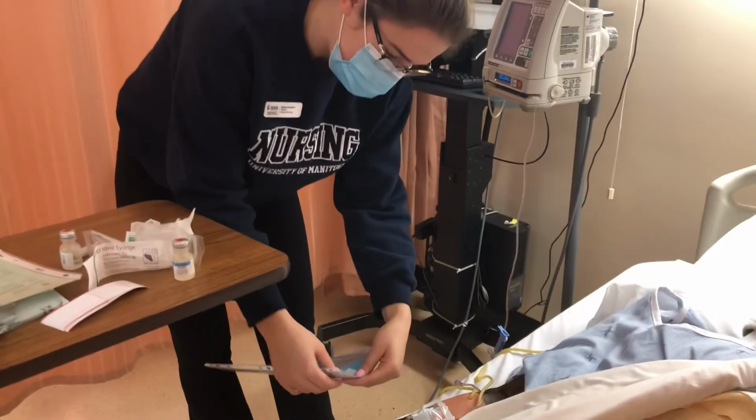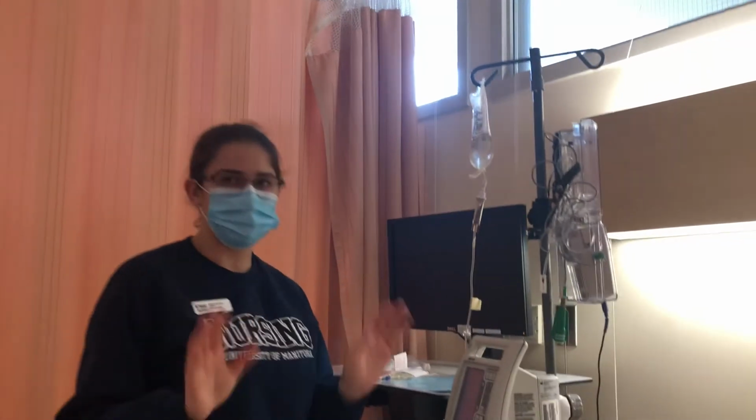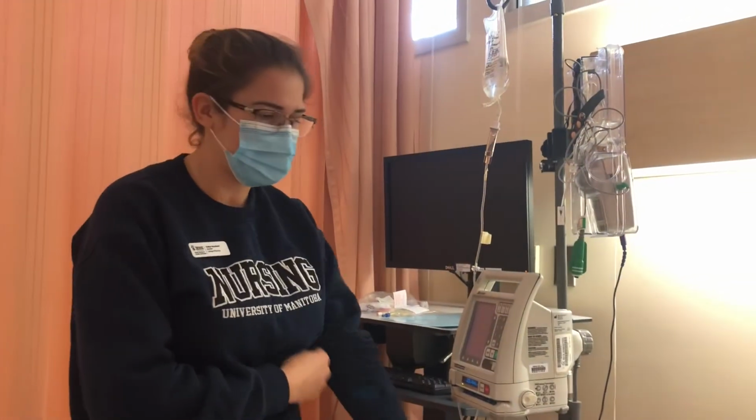I have Emma Wrightson. Her FIN is 1, 2, 3, 4, 5, 6, 7, 8, 9. So I know I'm the right patient. I'm asking the patient if they have any allergies, and they say that they have no allergies.